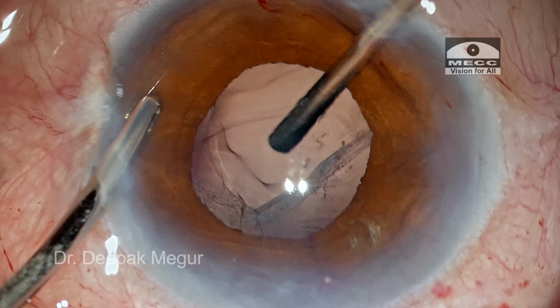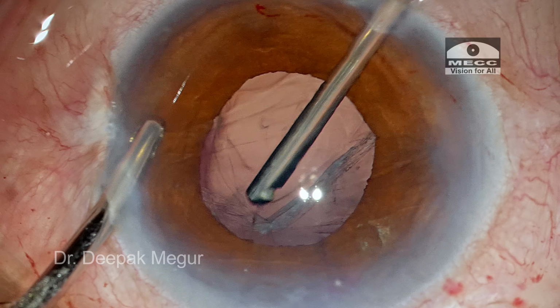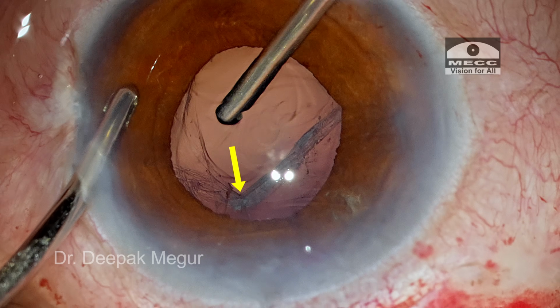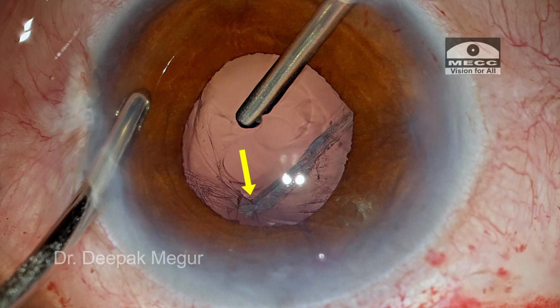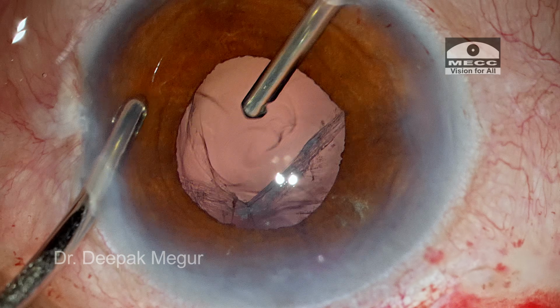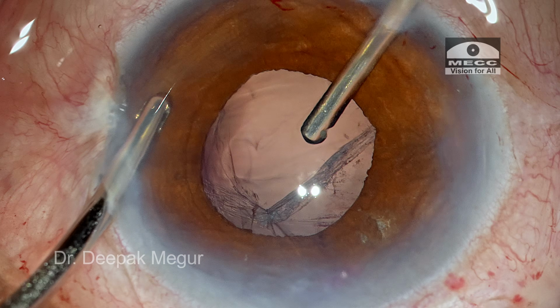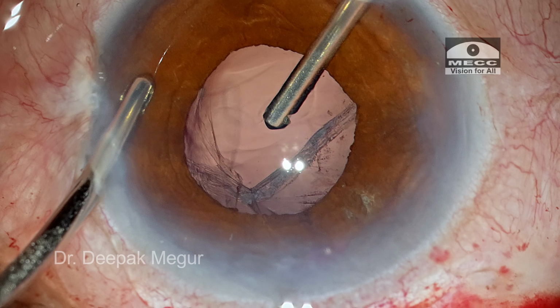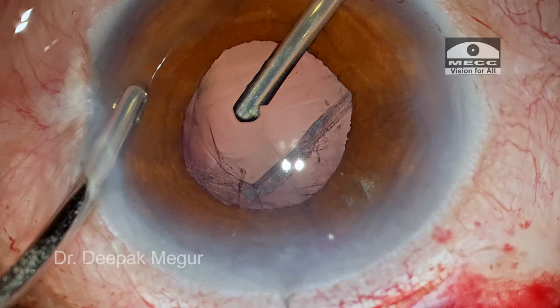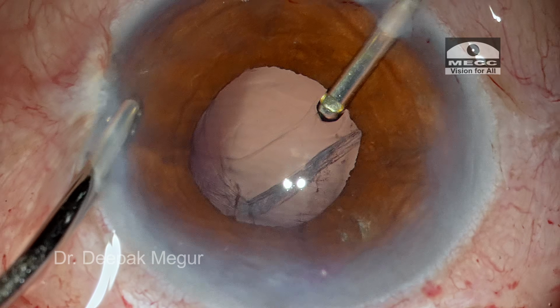So as the vitrectomy is being done, one can notice that the morphology of the posterior capsular tear does give us certain clues. I can see that the apical region of the posterior capsular tear is slightly kinked, suggesting possibility of a vitreous fibril there. And also the iris near the clear corneal incision in that quadrant appears to be slightly peaked. So again suggesting the possibility of a vitreous strand there. So I'm trying to reach that area with the cutter through the same port, but I'm not able to get access.